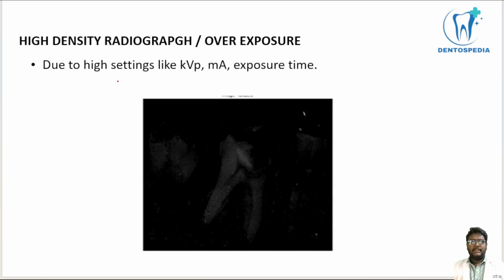Similarly, when we use high settings for kVp, mA, and exposure time, we will get this kind of black image. And in this picture too, we can't differentiate between enamel, dentin, and pulp. So we can't use these radiographs for diagnosis.